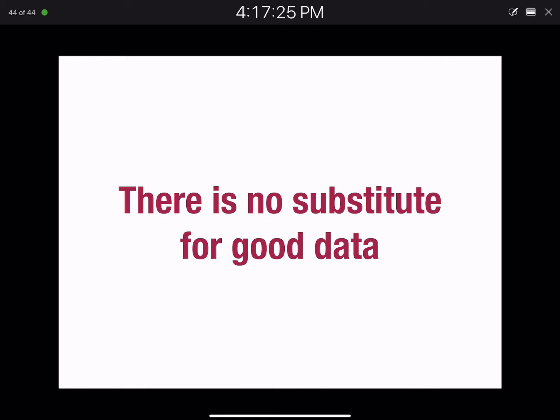And this is where we end. There's a lot that we'll focus on in the labs, which is, once you've collected the data, working with the data and cleaning the data up, all these different algorithms to correct for eye blinks and filter data and so on. But there's no substitute for good data. So the cleaner your data is going in, the happier you're going to be. All of these techniques that we have for signal processing only work kind of. And so, if you get noisy data, then all the processing in the world is going to make it a little less noisy, but it's not going to make it good data.